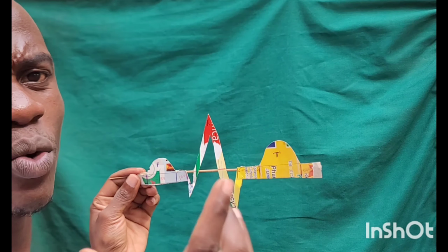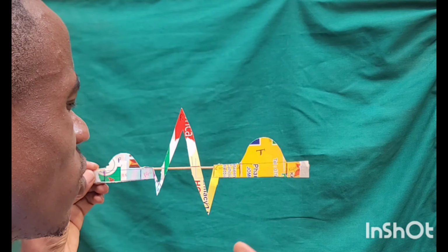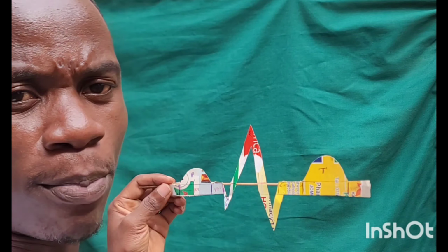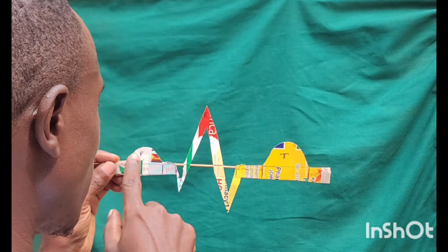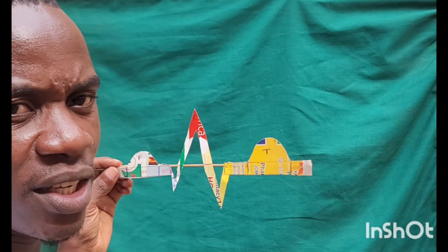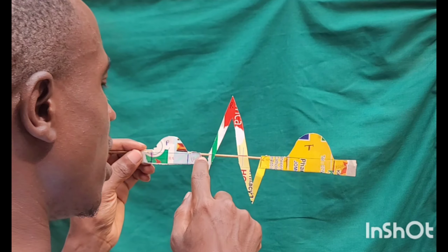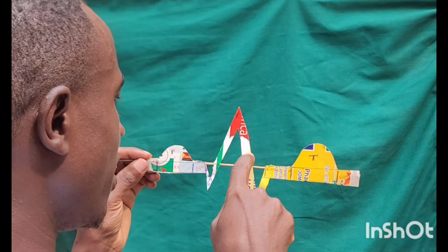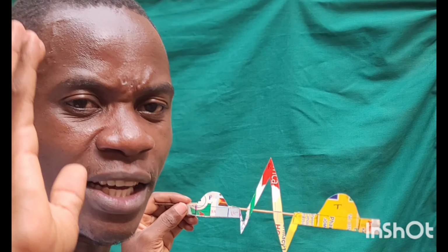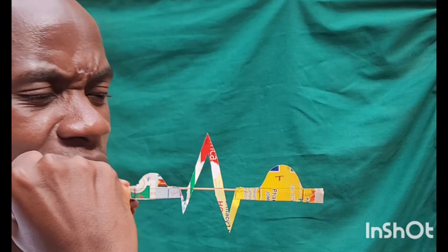Okay? Now that we have seen the orientation of how we call these waves, let's go ahead and see what all these waves stand for. Now, in the previous video, we were able to explain how all these waves come about. We said that this P wave was denoting what we call atrial depolarization. Okay, P wave was denoting atrial depolarization. Then this Q wave was denoting what we call septal depolarization, and it was a negative deflection. Then this R wave was standing for major myocardial ventricular depolarization. Okay, it was denoting what we call major myocardial ventricular depolarization.